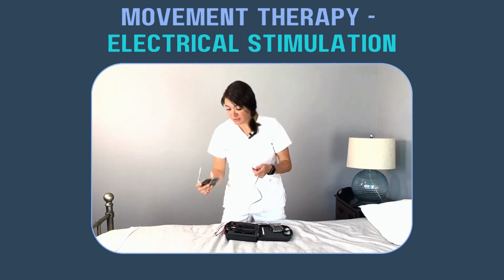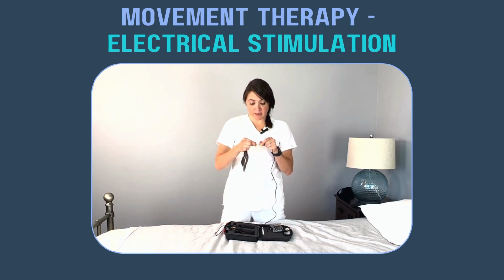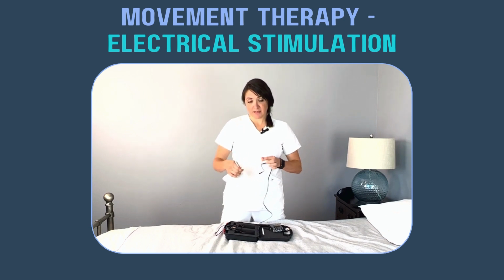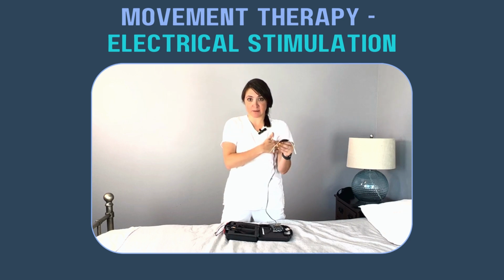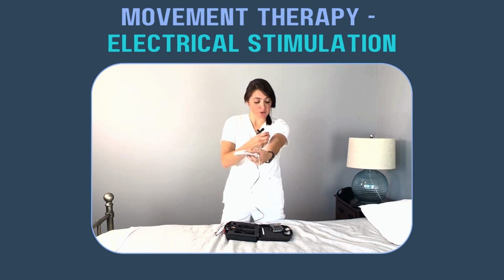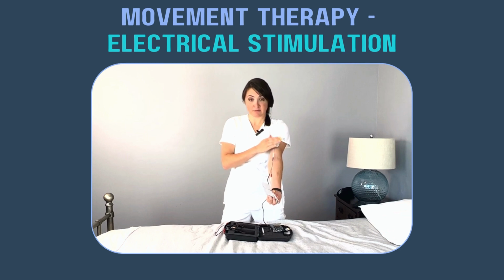For the wires, you're going to take the black prong and plug it into an electrode pad. And then you're going to take the red prong and plug it into an electrode pad. Super simple, right? I'll just show you for demonstration purposes on me first. I was taught in school to put the black electrode on top, closest to the torso, and the red on the bottom. But if you get a better connection by flipping that, red on top and black on bottom, that's totally okay.